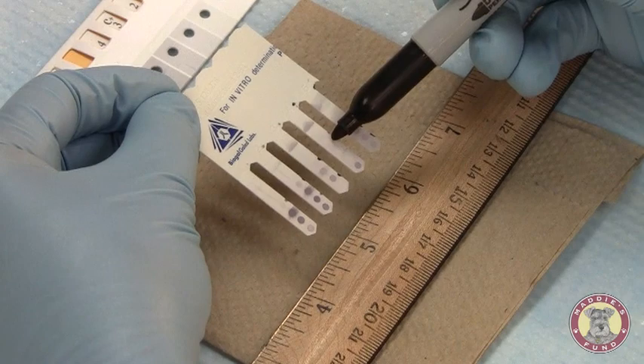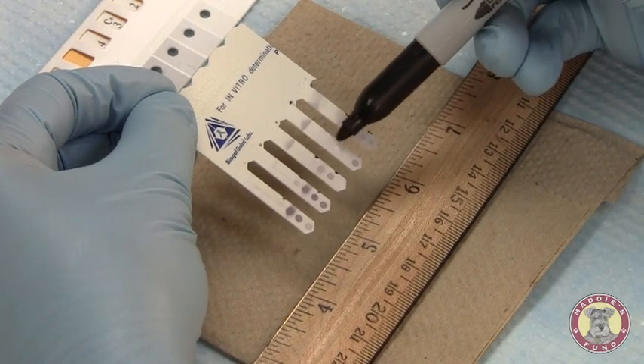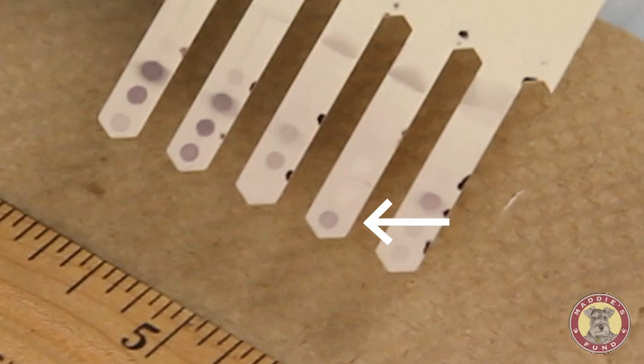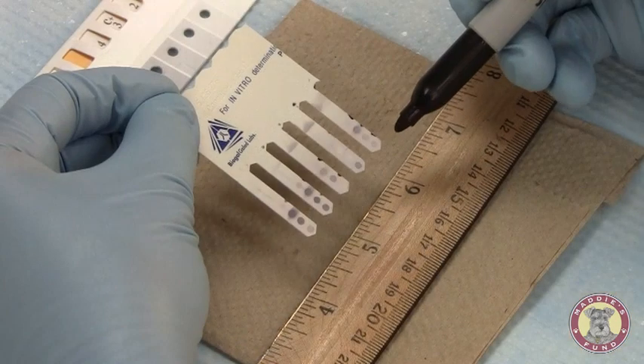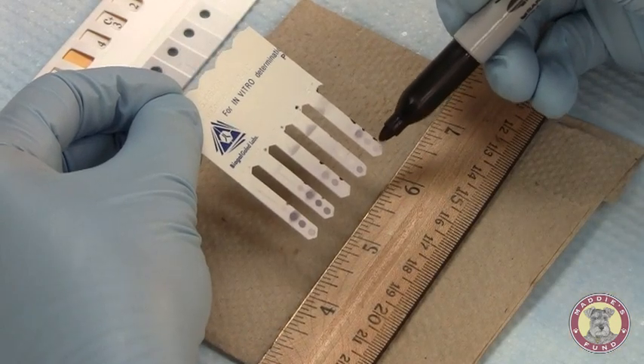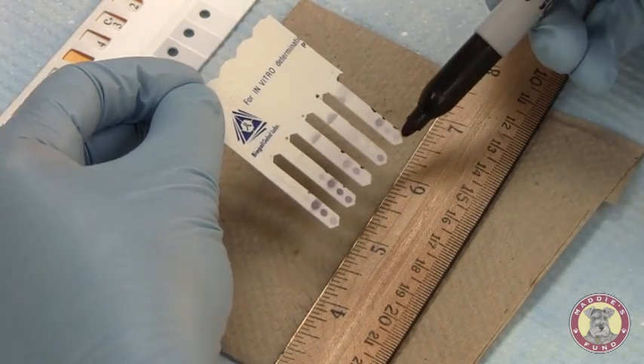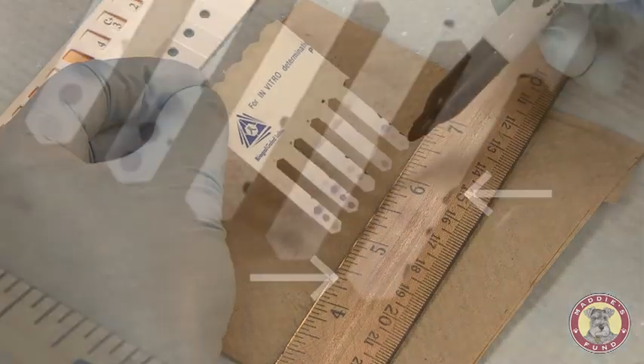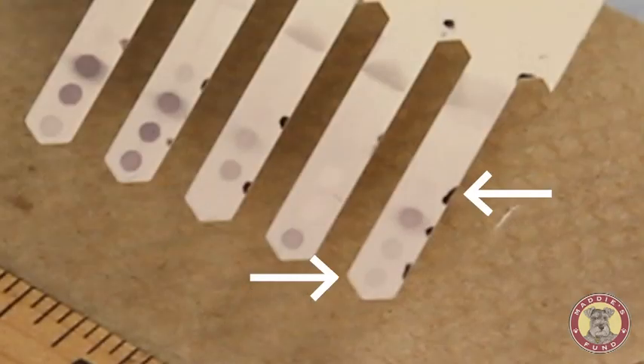Sample 4 — comparing it to our positive reference control, there's darker color development present. We'll call this sample a 4. Last, sample 5 — the two color development spots for canine distemper virus antibody and the positive reference control look the same. We will call that a 3.